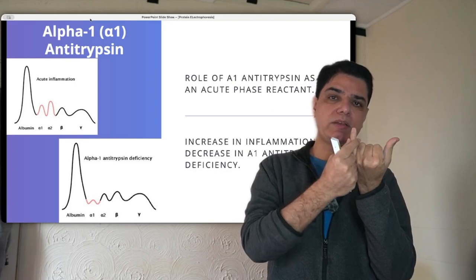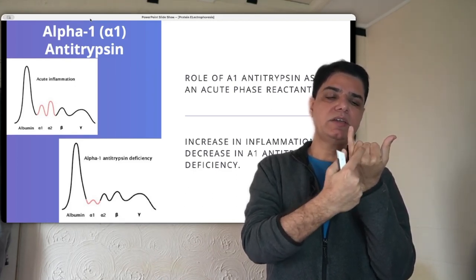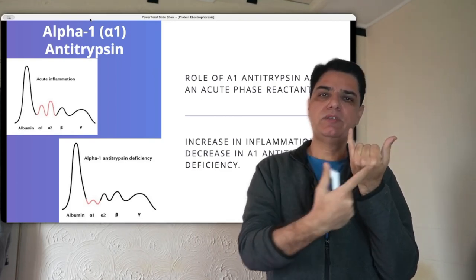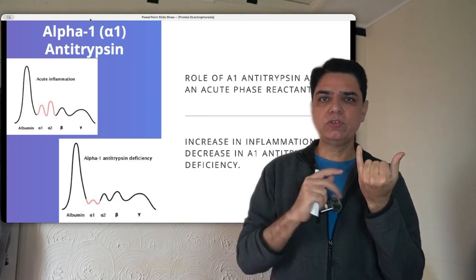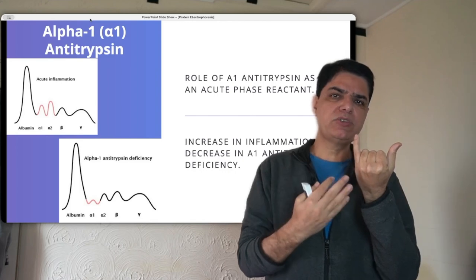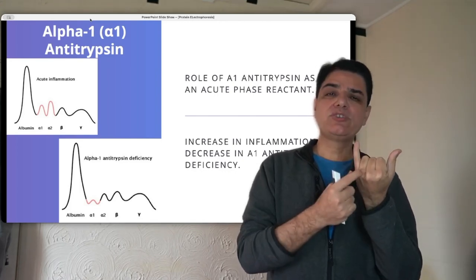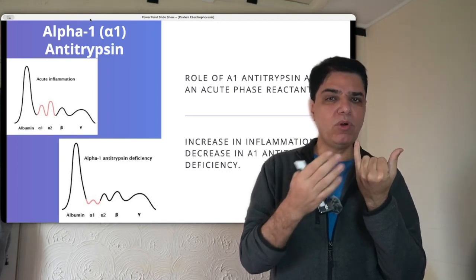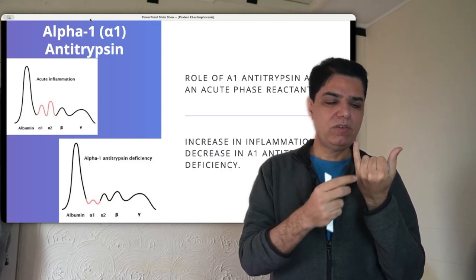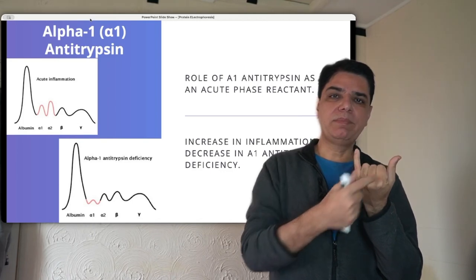First a sharp spike of albumin, then three small humps. Going from this side to the other side: alpha-1, alpha-2, beta, and then gamma. These are the different proteins, or globulins as we call them. So this is how you would normally see our protein electrophoresis. Based on the different disorders, these humps can go up and down. Let's talk about the first one. Albumin we all know, and I would come to albumin problems in some other lecture. For the time being, we'll be talking about the other proteins: the alpha-1, alpha-2, beta, and gamma globulins.